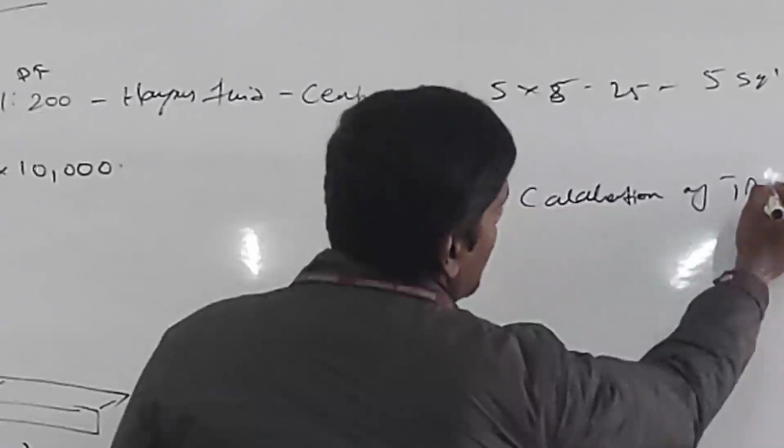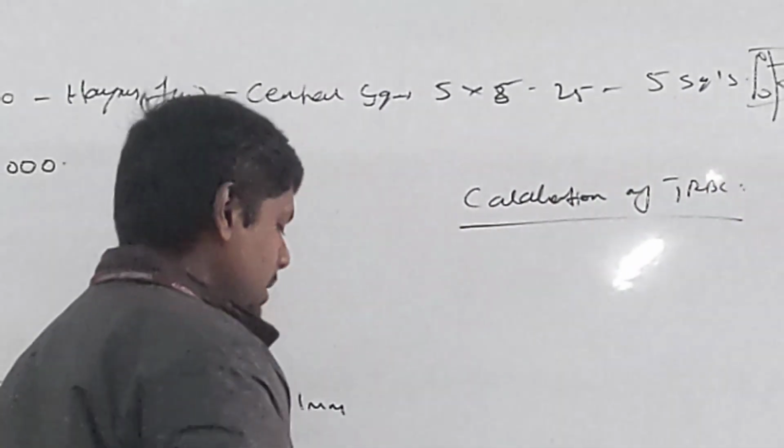Calculation of TRBC. So how will you calculate? Write down the calculation.